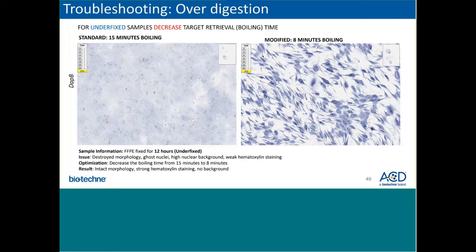Similarly, for underfixed samples, to help remedy over-digestion, you would then try and decrease your target retrieval time. Particularly on the left side, we're looking at samples that are FFPE fixed for 12 hours, so underfixed as compared to our 16 to 32-hour suggestion. Here at the standard 15-minute boil, the tissue morphology has been destroyed, and you see ghost nuclei, and there's also a high nuclear background, as this is the DapB negative control that we're looking at, and a weak hematoxylin staining.